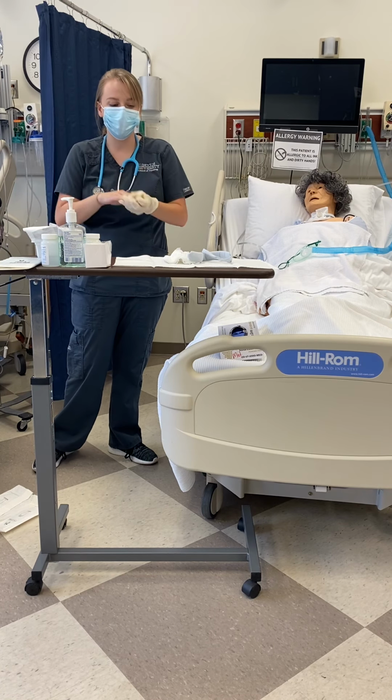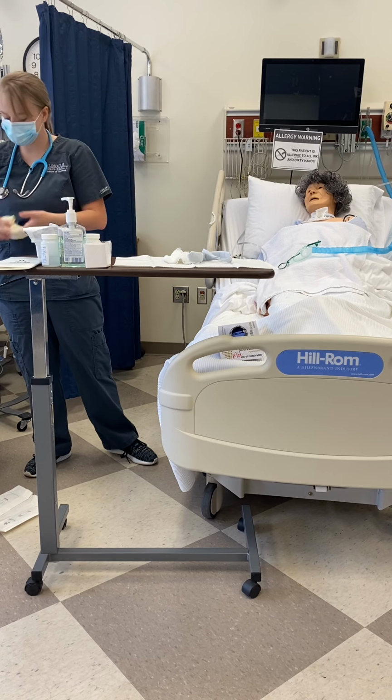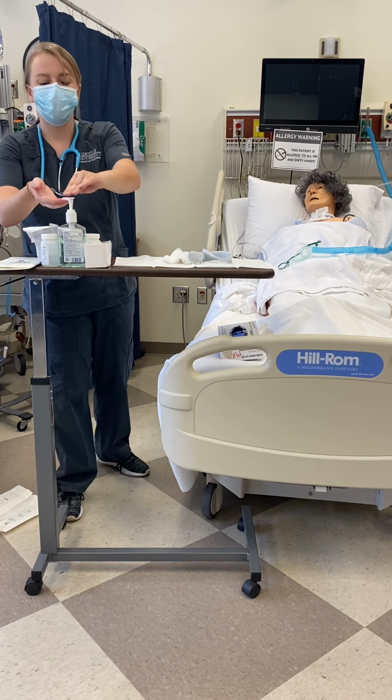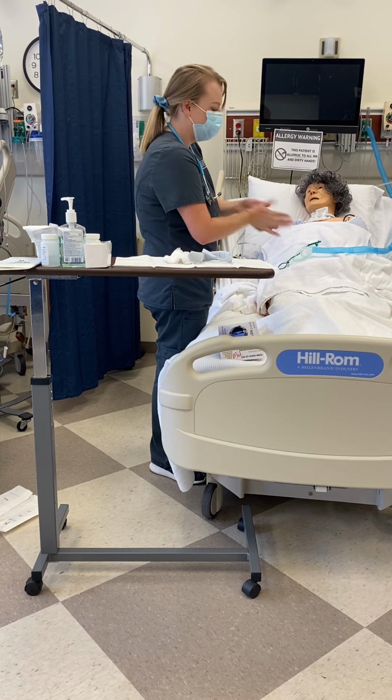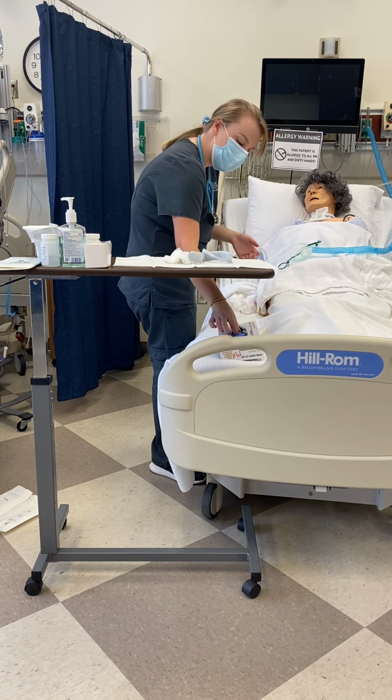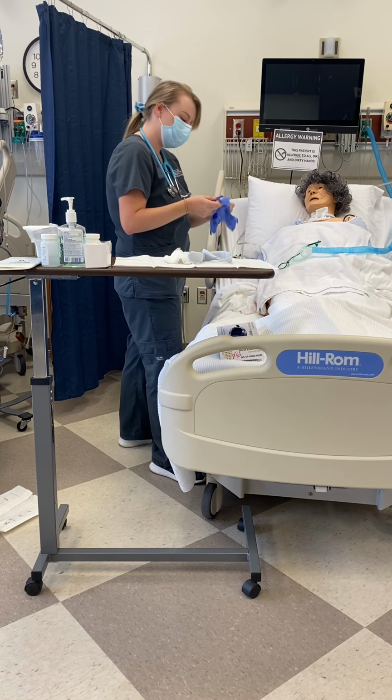At this point, I can take off my sterile gloves, hand hygiene, and I can just put on clean gloves to change the necktie.